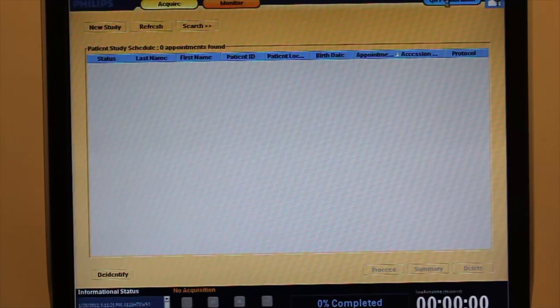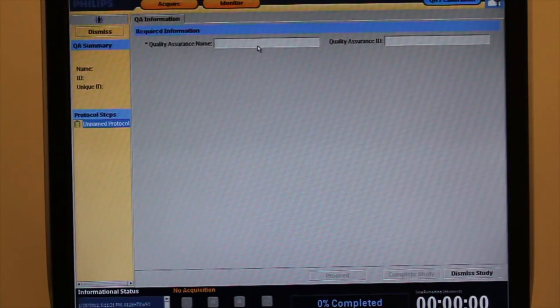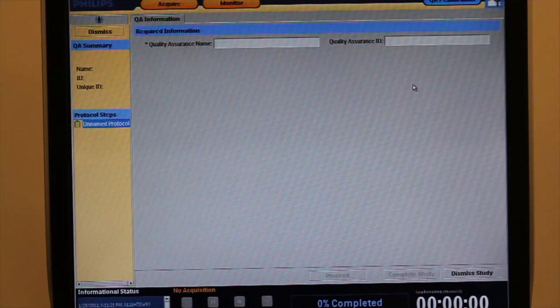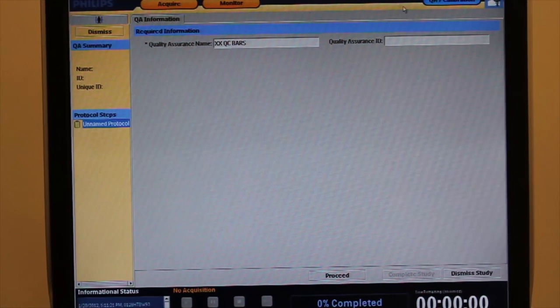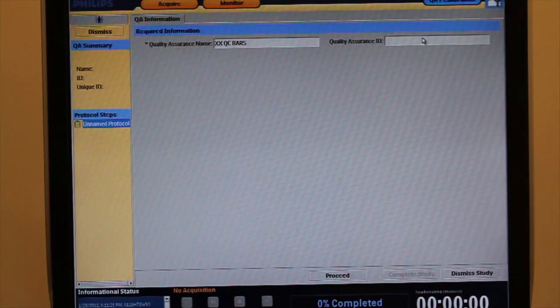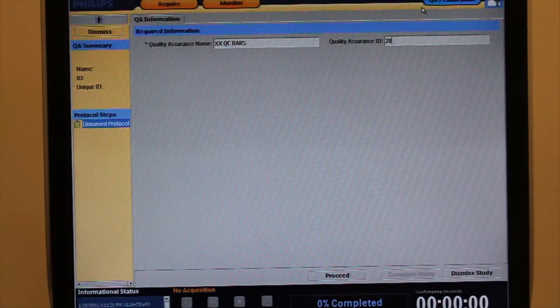Enter the QA calibration menu from the main screen of the Jetstream Acquisition Program. Entering the study data: Study name in capitals, double X space QC space bars. Study ID, date and your initials.